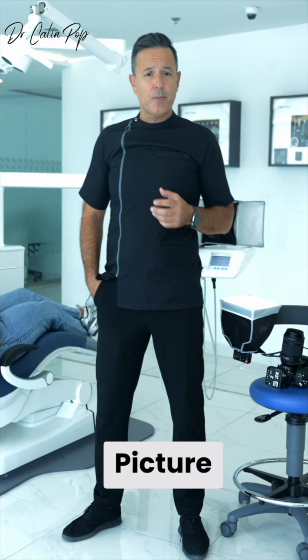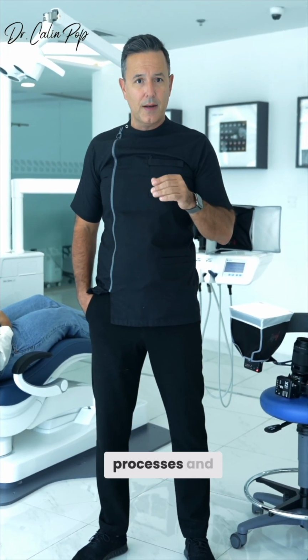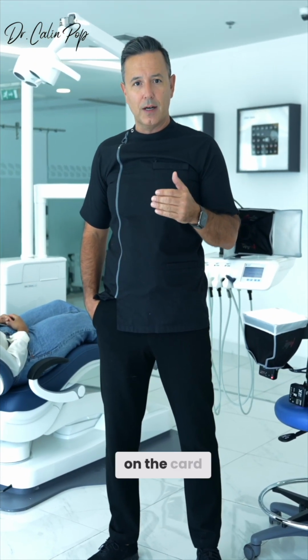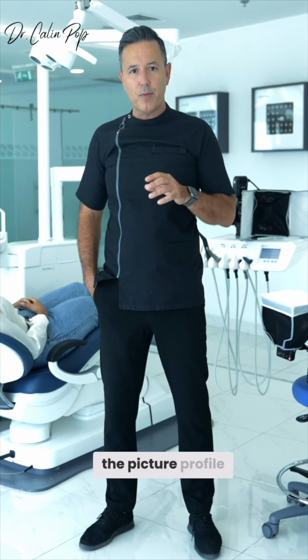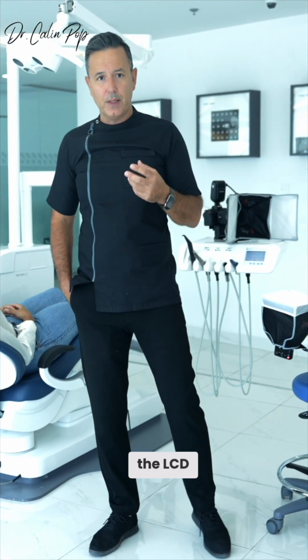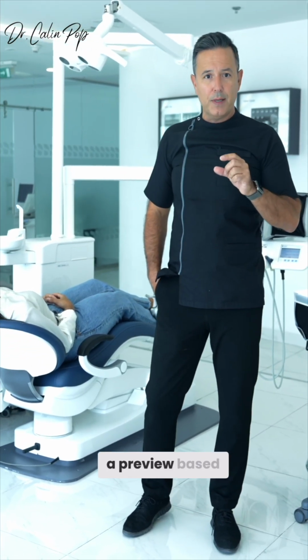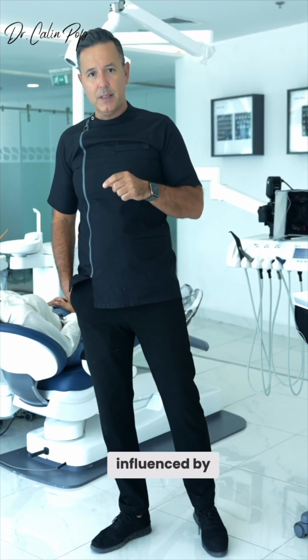Picture profiles. A picture profile on a camera is a set of settings that determines how your camera processes and renders the image before it's saved on the card, so it only applies on the JPEG file. If you are also shooting raw photos, the picture profile is not applied permanently on the file. Yes, indeed, what you see on the LCD screen of the camera is just a preview based on your selected profile, but the actual raw file is not influenced by the picture profile.